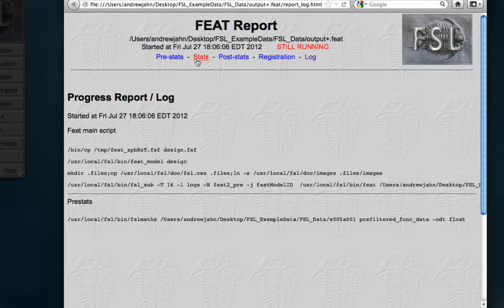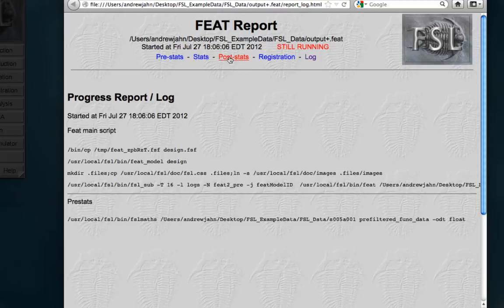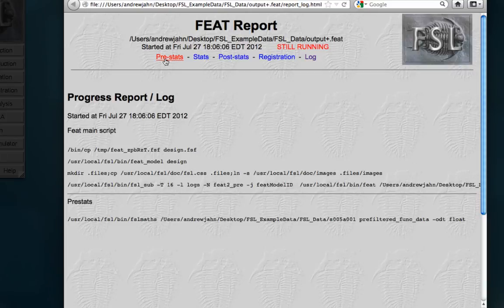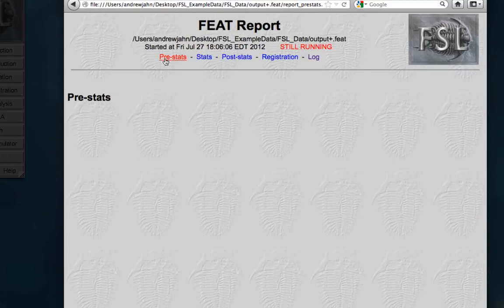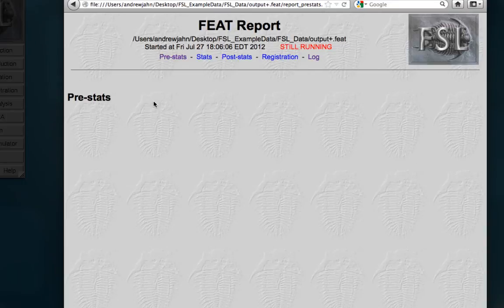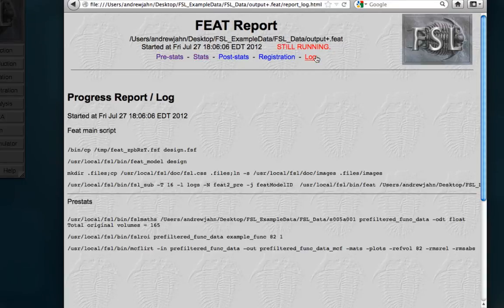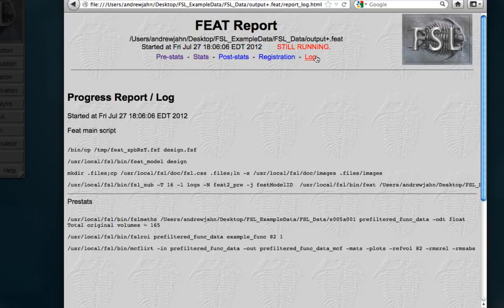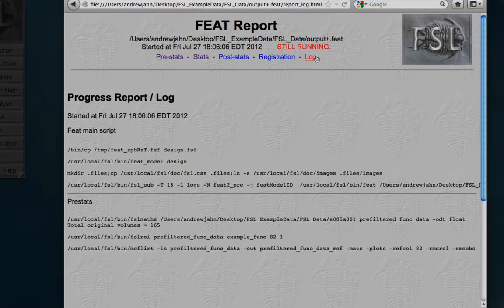We have Pre-stats, Stats, Post-stats, and Registration. All right, now it says still running, so it's still crunching through some numbers, but after each step is completed, you can click on these tabs, and you'll see some results. Now, we don't have anything yet, so it's going to say not run, so all we need to do is sit back and wait for the analysis to finish.